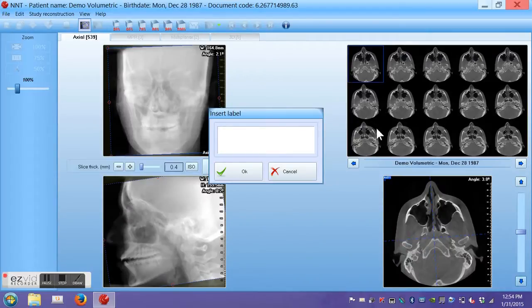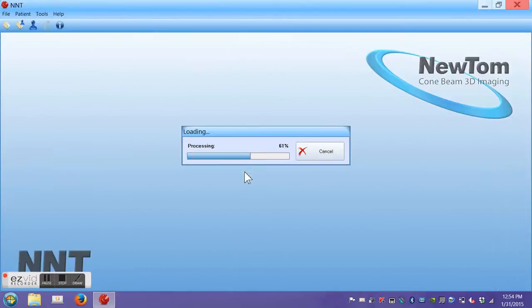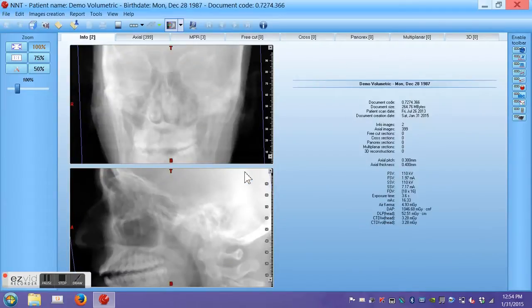Now we can insert a label by typing in the plan for this patient. This is an implant number 20 position. Click OK. And now we have generated our beginning study.